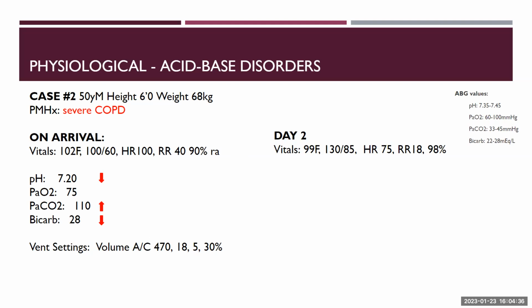And based on the ABG on the left, it's respiratory acidosis because the CO2 is high. I think they're breathing fine, but the fact that they're on 98, I know we were saying earlier because it was COPD, we want them lower. Great. But that's my main concern.